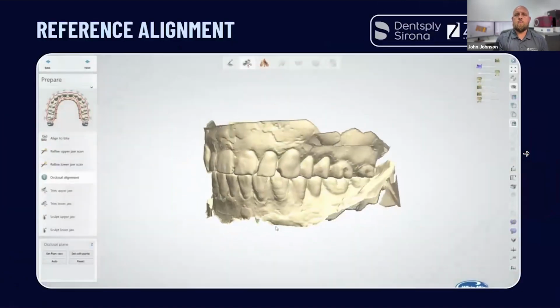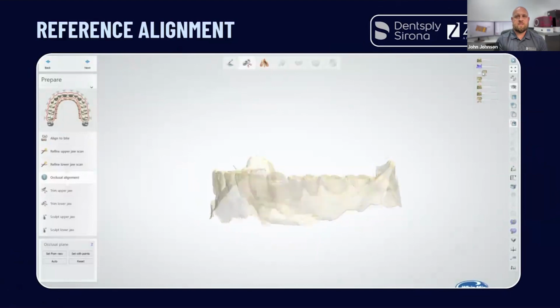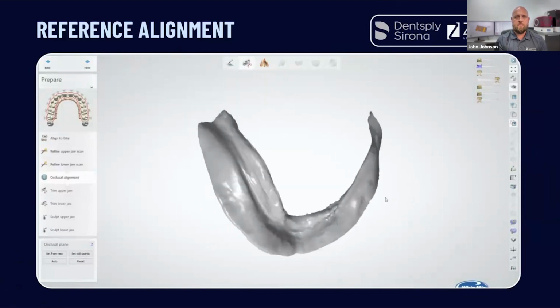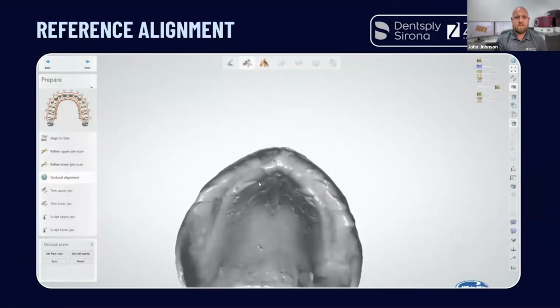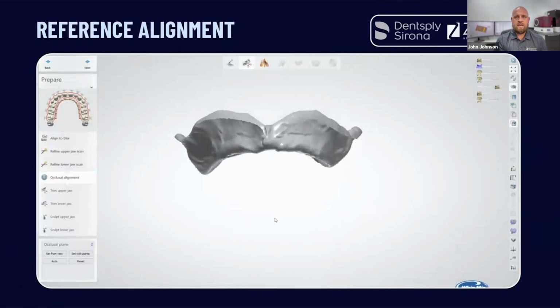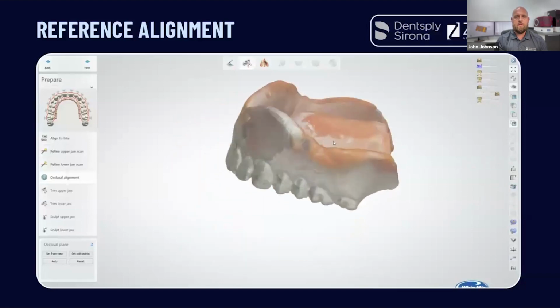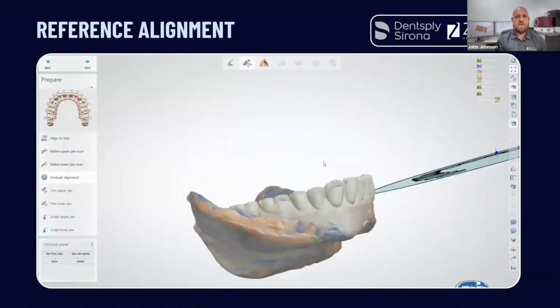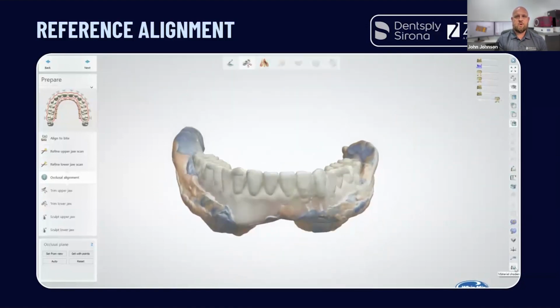And then now we take that data back and we start putting the pieces together. So we've got the first scan of her current dentures and the bite. This is our lower intaglio scan. This is our upper intaglio scan. And now the challenge is I've got to get that upper intaglio scan oriented with the lower intaglio scan so I can get started to build a denture. And I'm just kind of showing you all the pieces as they were.